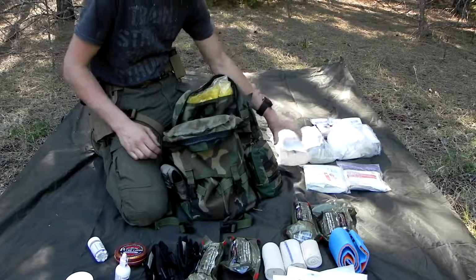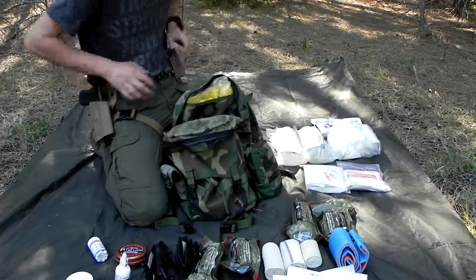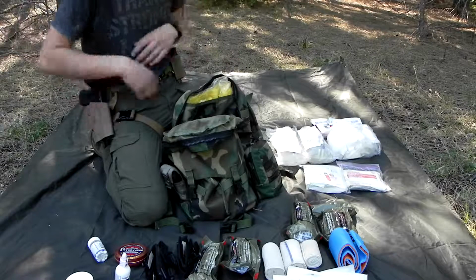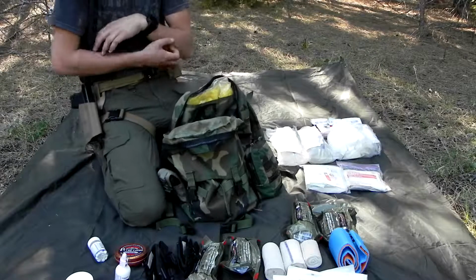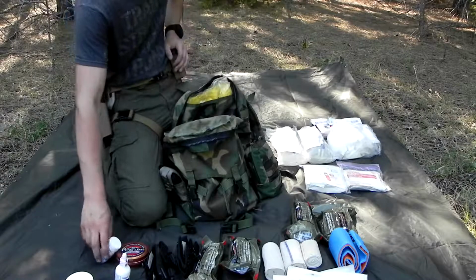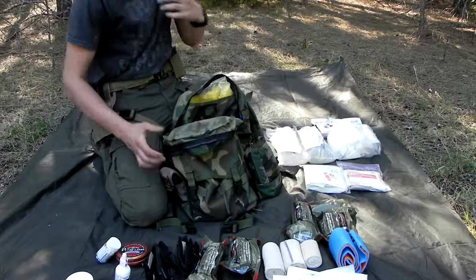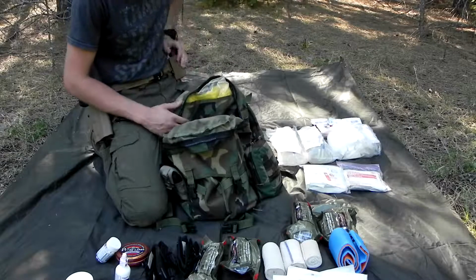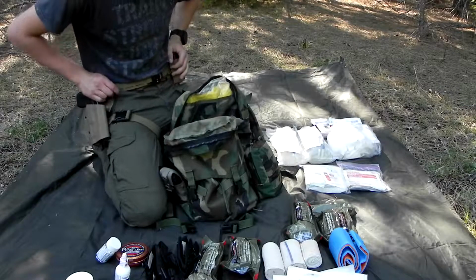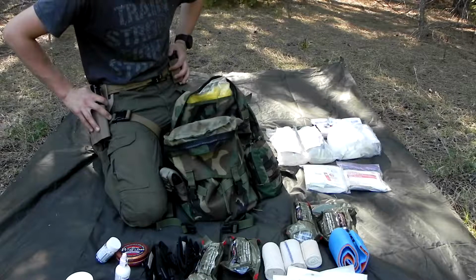Because even these spike kits, you're supposed to change them out; there's a certain period of time you have to change them. They want you to change the spike in the bag. Now that's not something I have the luxury to be able to do in the field, so I do what I can with the equipment I have, because you can only carry so much weight. This goes on the back of my ruck, so this is another probably 15-20 pounds of equipment on my back, on top of my 35-40 pound ruck, depending on what I'm packing and carrying, plus my plate carrier and my first line gear. I mean, it's a lot of equipment.